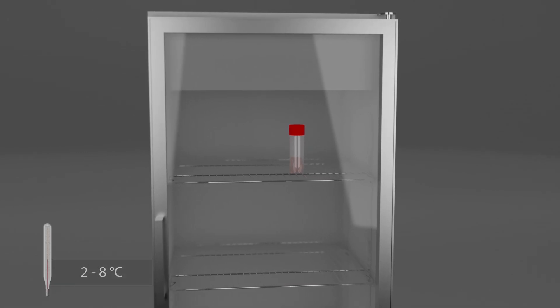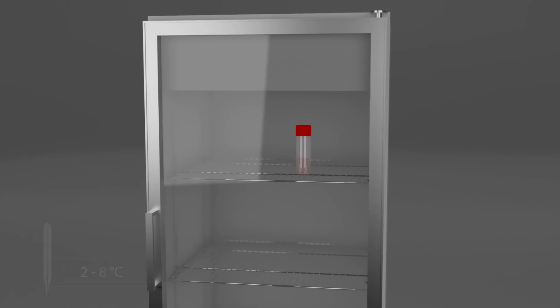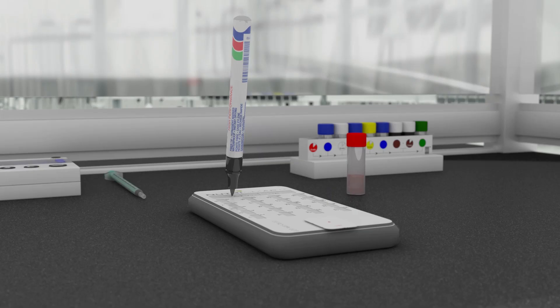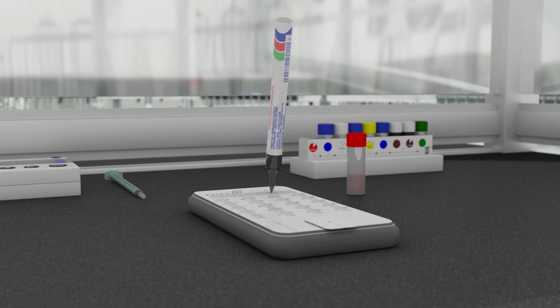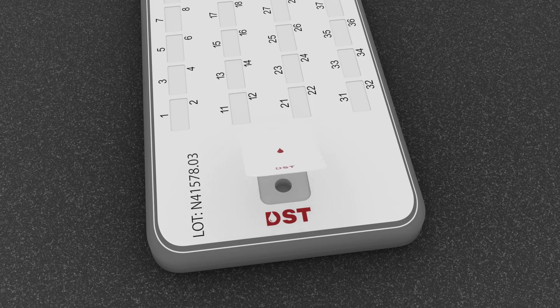Cover the patient's finger with the plaster provided. Once added to the diluter, the sample can be stored at 2 to 8 degrees Celsius for up to 72 hours. Use a pen and write the patient's name and surname on the NutriSmart cassette. Remove the sticker but keep it close by as it will be needed again later.